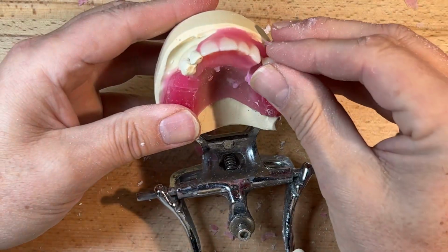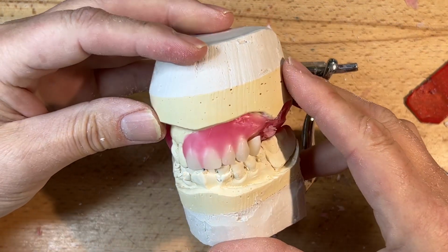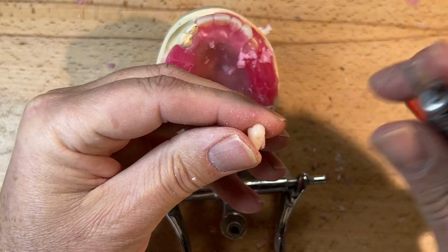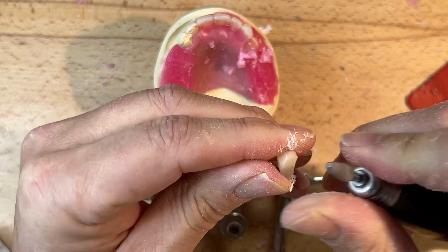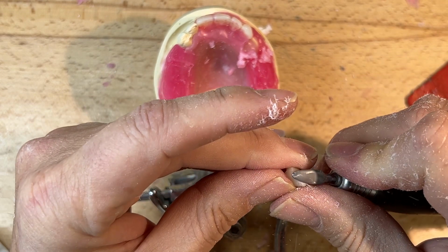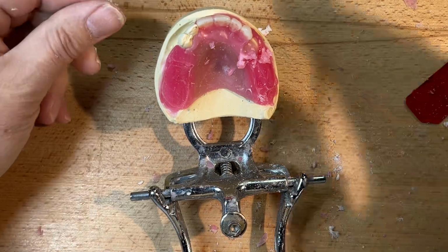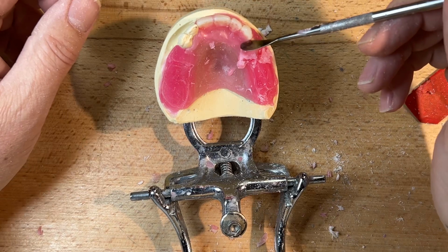Not a huge fan of this composite denture teeth, but for the interim, that's fine. I've shut down the suction just for the video, but I'm just reducing a slight amount of tooth structure. Keep the ridge lap. Again, I don't want the wax or the base plate to dictate my setup.